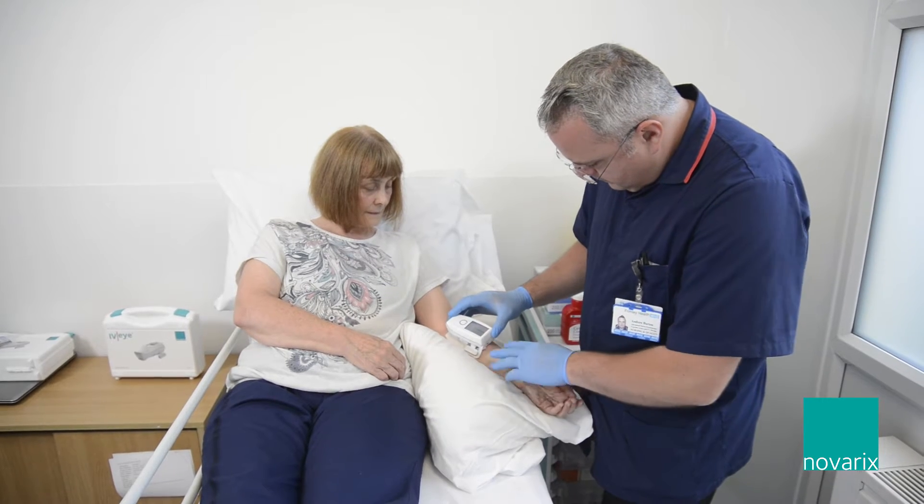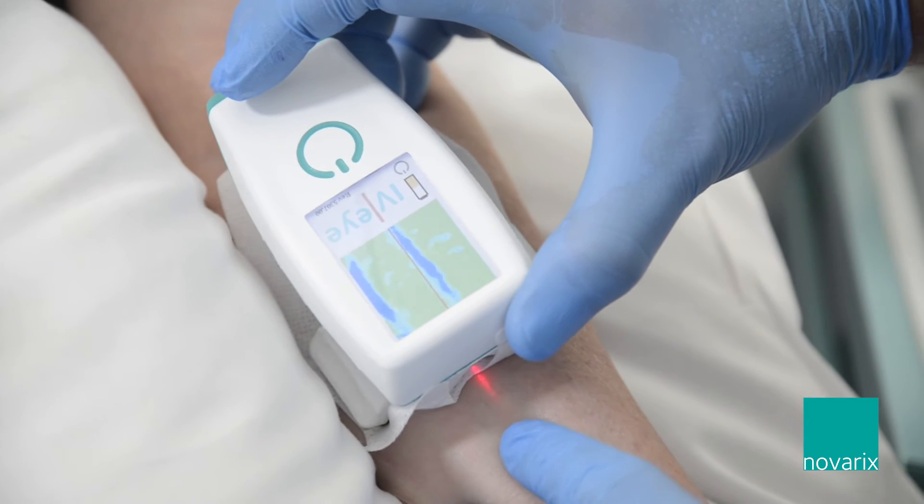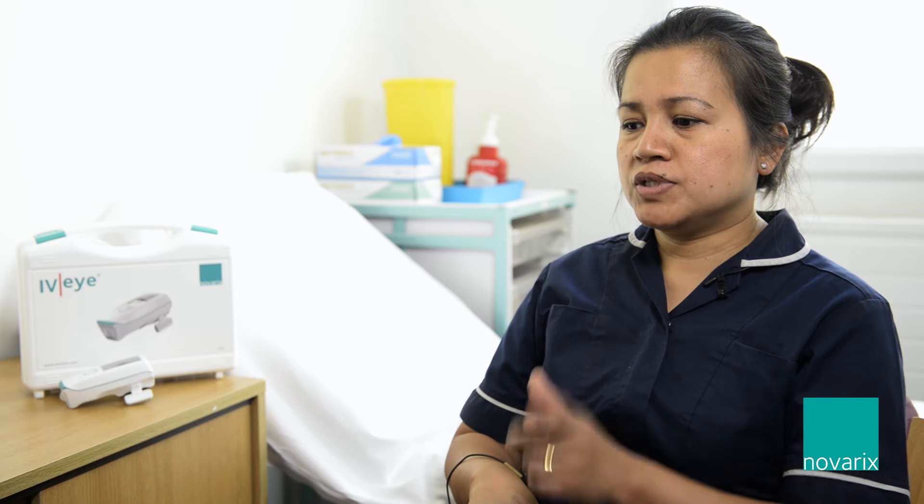Benefits of using the IVI over the ultrasound is that I can visualise superficial veins at the back of the hand when I'm using paediatric cannulas for chemotherapy patients. Because they're superficial, the ultrasound won't be able to visualise them because there's not enough tissue.